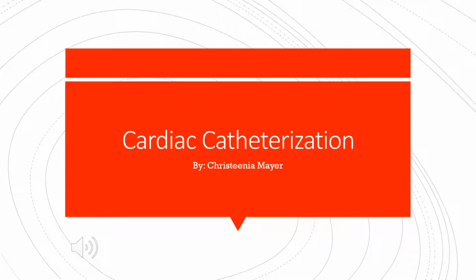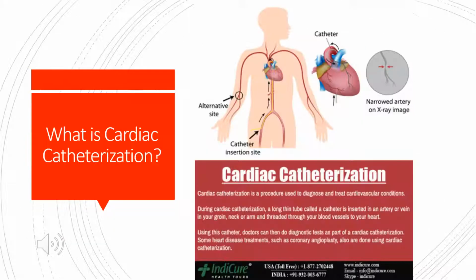Today, I'm going to talk to you about cardiac catheterization. So what is cardiac catheterization? Cardiac catheterization is a procedure used to diagnose and treat cardiovascular conditions.